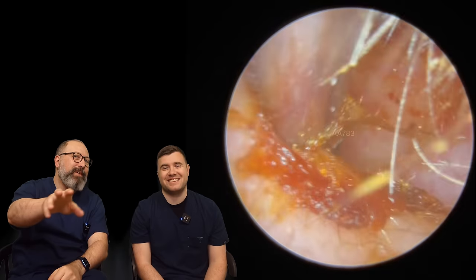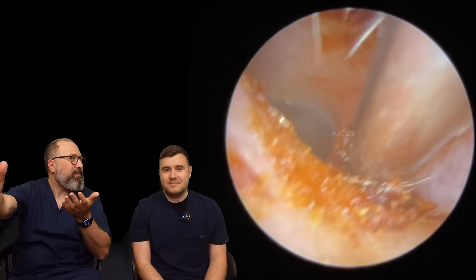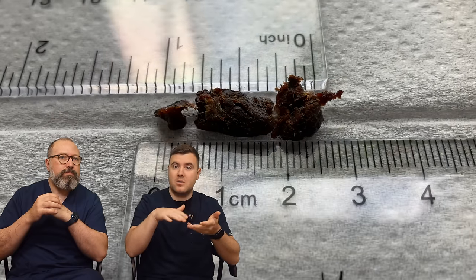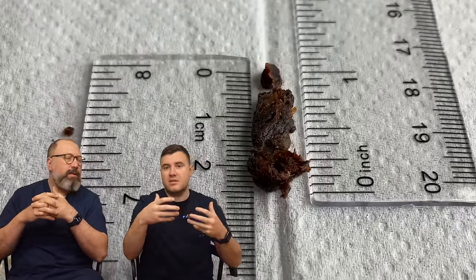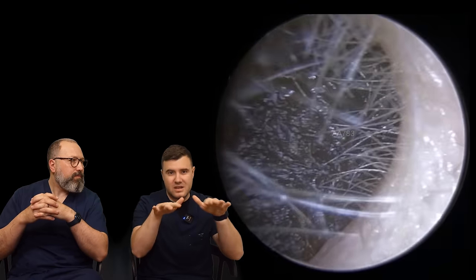Nice big plug — that actually came out a lot better than I thought it would. We talked in a previous video about these bits you have to clear up at the entrance — sometimes they can be a bit of a pain. You could see that long strip of dry skin going further back, but it actually came away really well. Those little thin bits of dead skin as they start to lift and peel away off the ear canal — if it's still quite dry, they tend to crinkle and make a lot of whistling, and you just can't be in the ear when that's happening. You need to come straight back out — that's a lot of the reason why we tend to leave these little tiny thin layers of skin. That was about two and a half centimeters — one inch.